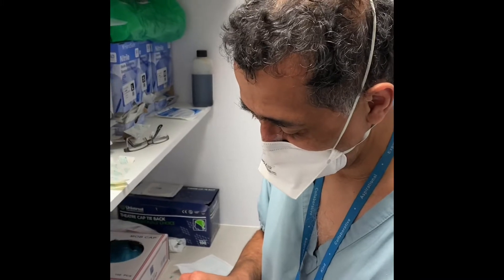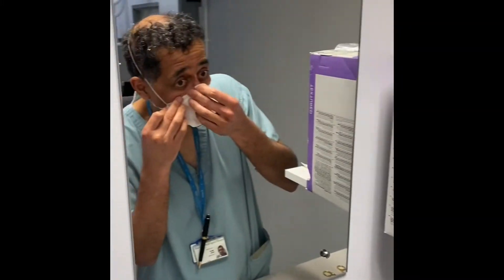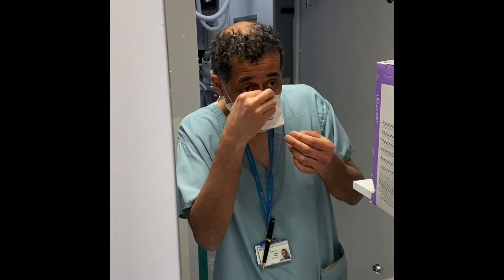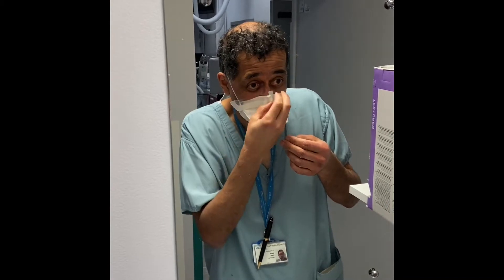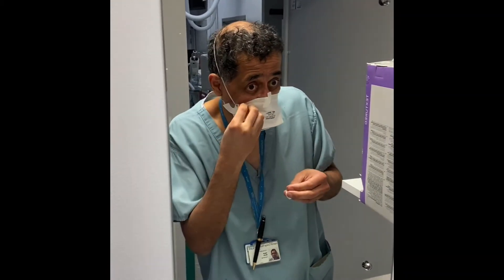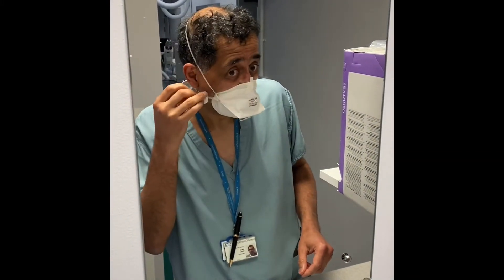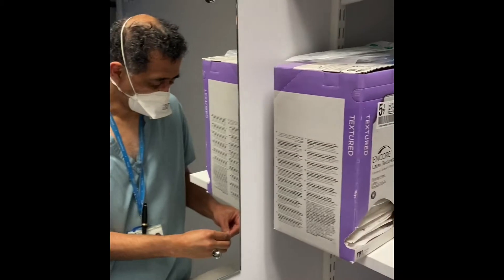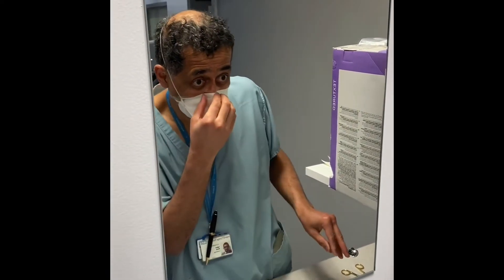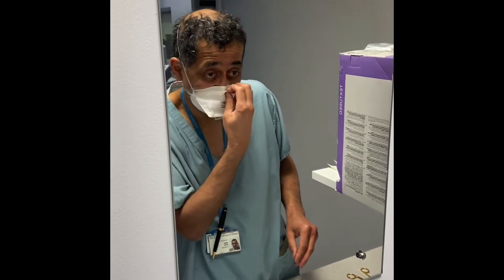Otherwise when you put the goggles on you can't see a thing. The top seal is stopping your glasses fogging. It can become quite difficult to peel the paper off — it doesn't want to come off — but it's better to spend another minute doing this than risk getting infected or your goggles fogging up, because then you really cannot do an angioplasty.